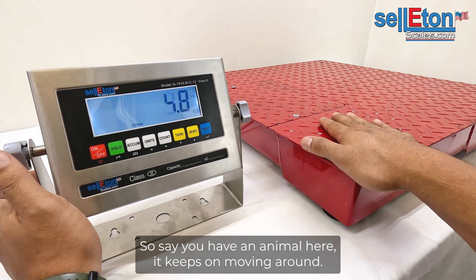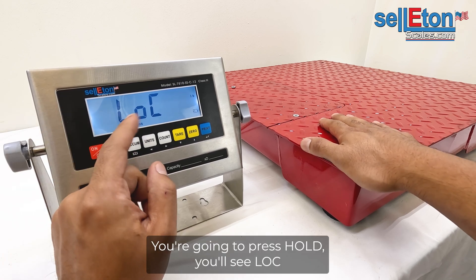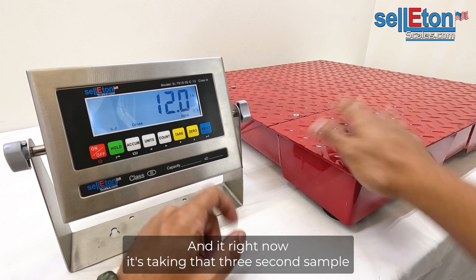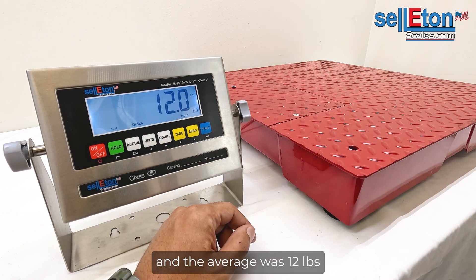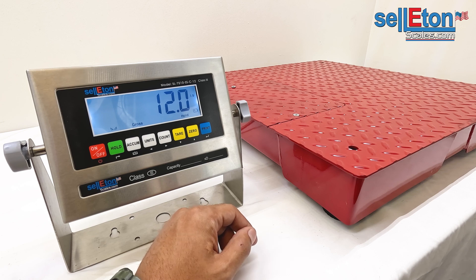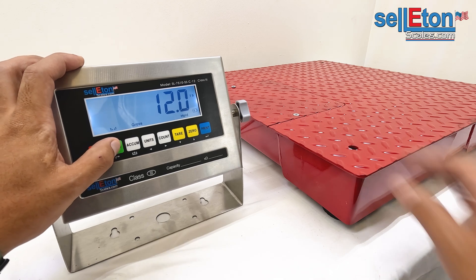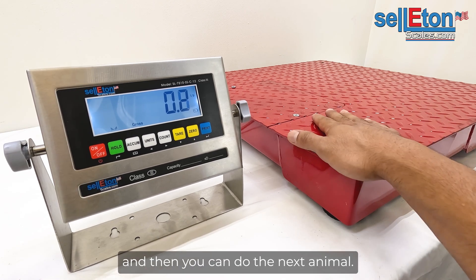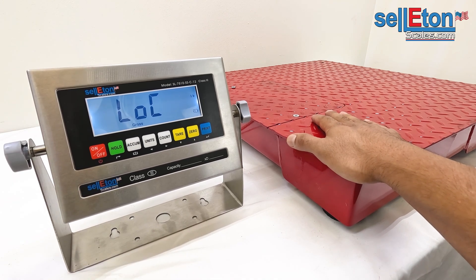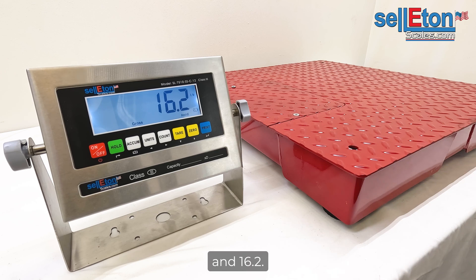Say you have an animal that keeps moving around — you're going to press hold and you'll see LOC. Right now it's taking that three-second sample. The average was 12 pounds for those three seconds with the animal on there. To clear it, press hold again and you can do the next animal. We'll do it again — and 16.2.